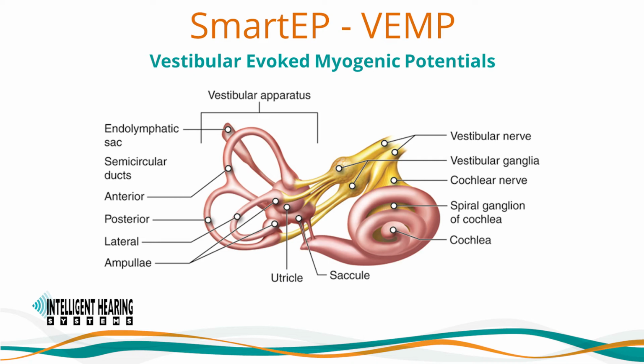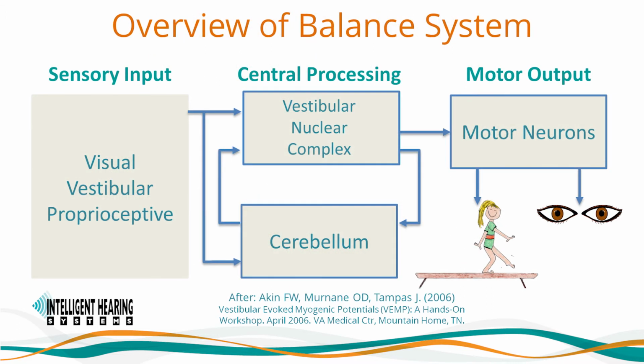Welcome to this training session for SmartEP Vestibular Evoked Myogenic Potentials by Intelligent Hearing Systems. Today I will walk you through the patient and software setup for performing and analyzing a cervical cVEMP and an ocular oVEMP test. Let's first review some basics on the balance system.